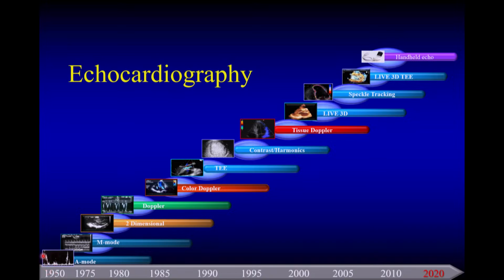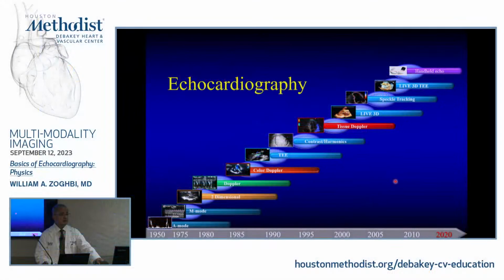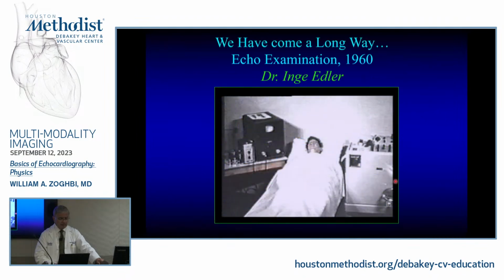This is the A mode, M mode, 2D, Doppler, color Doppler, TEE, contrast, tissue Doppler, live 3D, speckle tracking, 3D TEE, and handheld devices, where the principle is exactly the same. And that's the beauty also of ultrasound. You can miniaturize it so much to be at the bedside and with a handheld device. I usually end it with a look back at Dr. Inge Edler, who is the father of ultrasound.